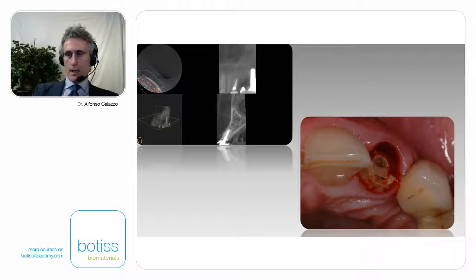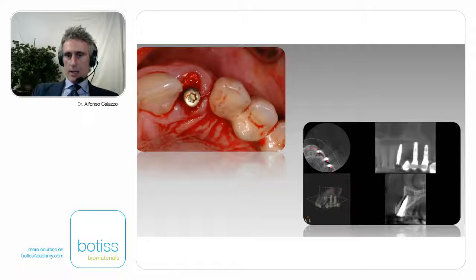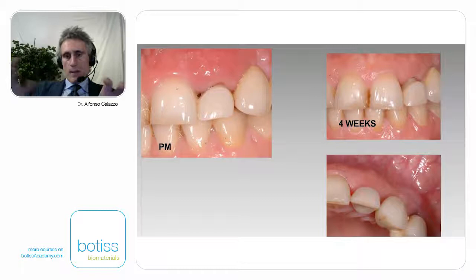So I take out the tooth, take the impression, put in the implant, take the impression for the temporary, and do the buccal plate preservation technique. Then the CBCT right away: some bone at the collar, some bone outside on the buccal plate. In the afternoon, the patient will have her temporary placed, and then you wait. Of course, your temporary looks terrible. You want to leave the tissue not compressed. You don't want to squeeze the tissue there. You want to leave the tissue growing on your temporary, doing the creeping effect, and then push it up later, start conditioning the tissue. Of course, you have to play with the soft tissues.